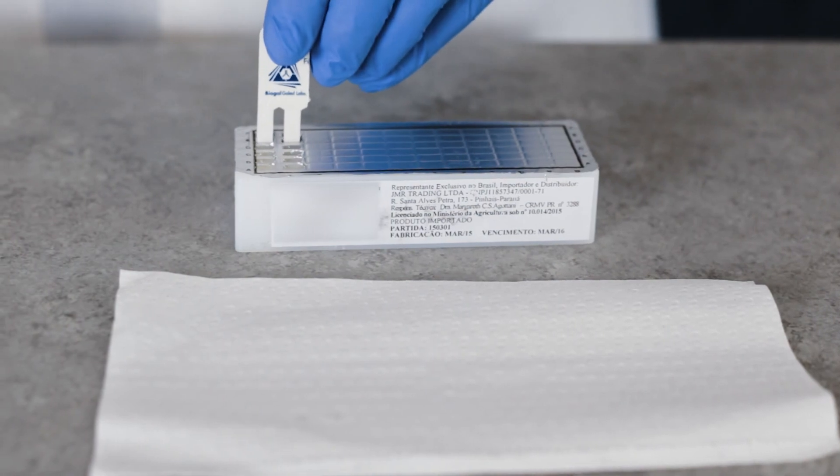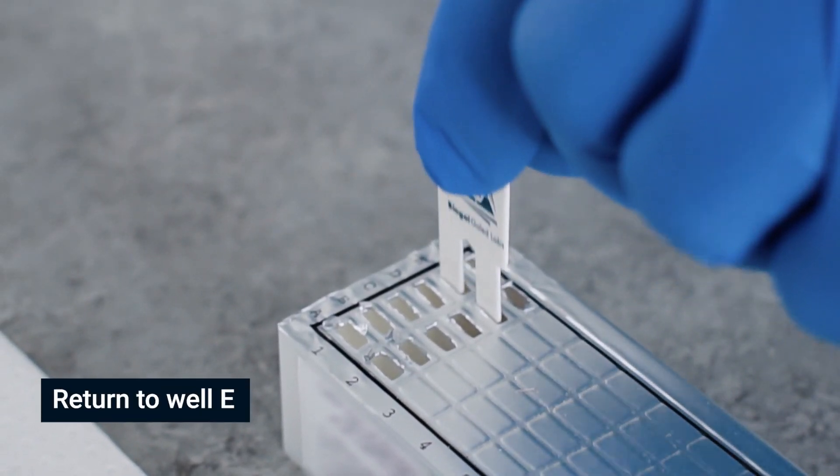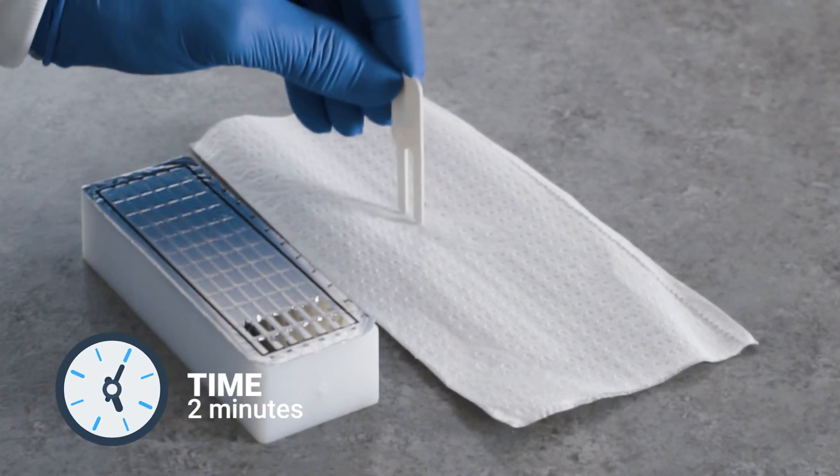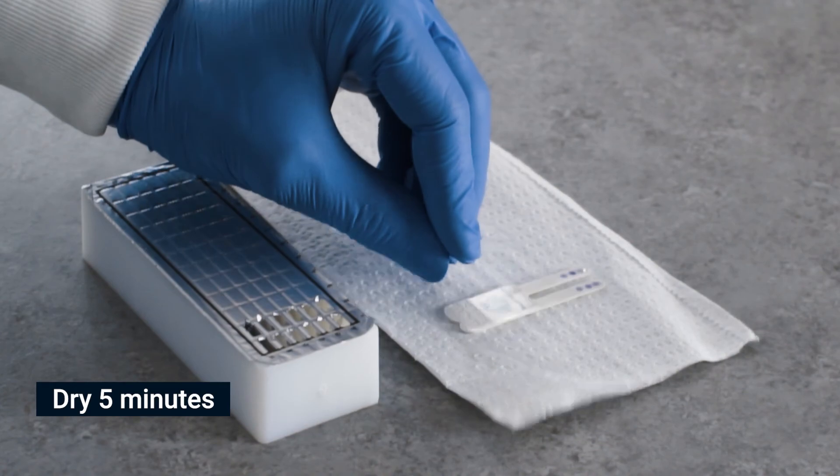After piercing the foil for color development in row F, move the comb back to row E for 2 minutes for color fixation. Take the comb out and let it dry for 5 minutes before reading the results.